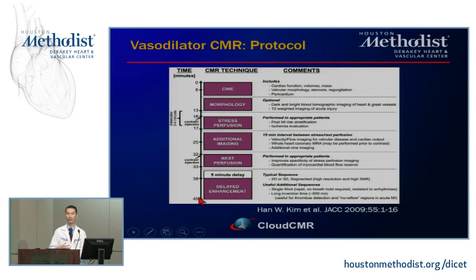I know nuclear has an accelerated protocol where they actually get stress first, and then if there's any abnormality, then bring the patient back. But in this case, we actually get the rest images for reasons I'll explain very shortly.